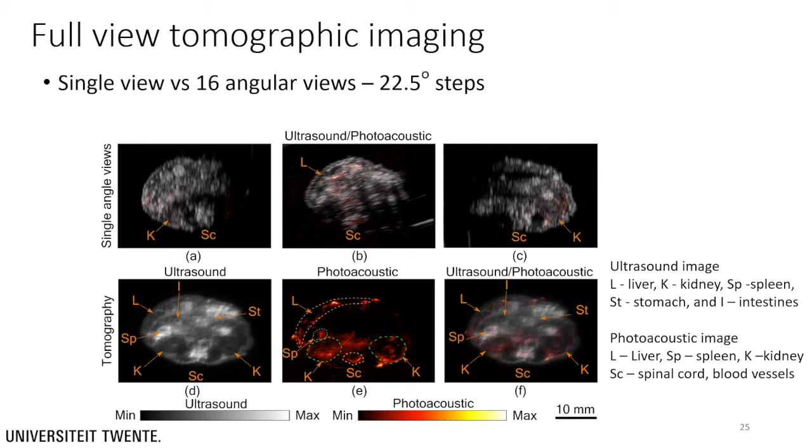Images like these show that it is essential to have both the photoacoustic and the ultrasound image. While the photoacoustic image alone is difficult to interpret, the ultrasound image casts a much better light on the anatomy of the object. So you could say the photoacoustic image gives the function associated with the presence of blood vessels, and the ultrasound image gives the structure.